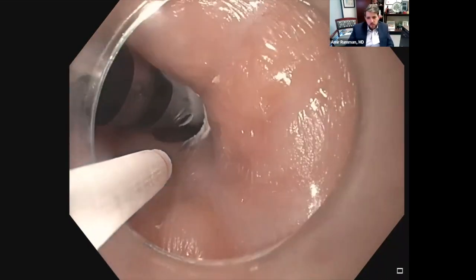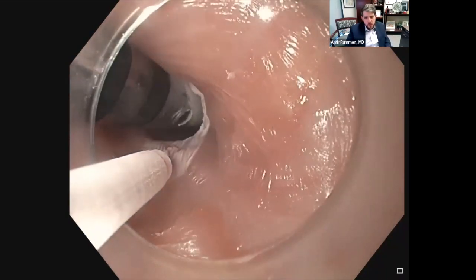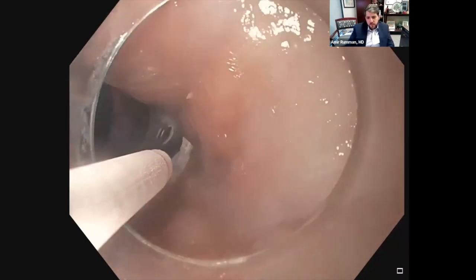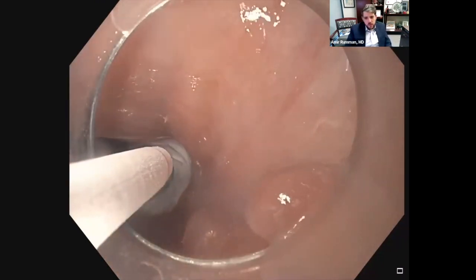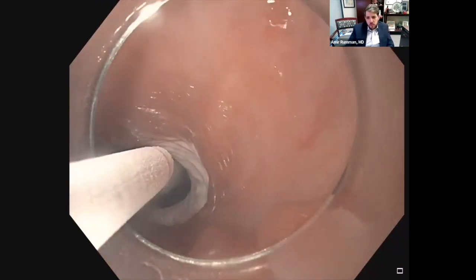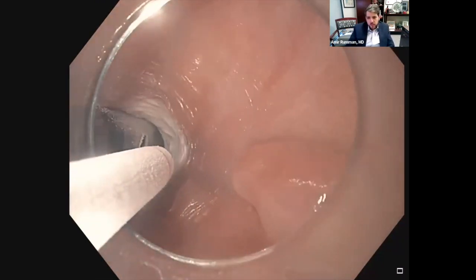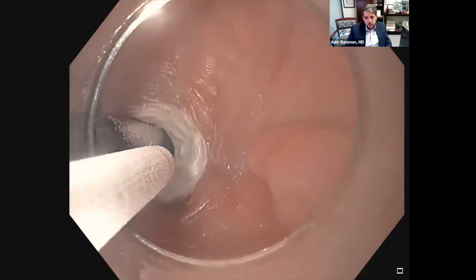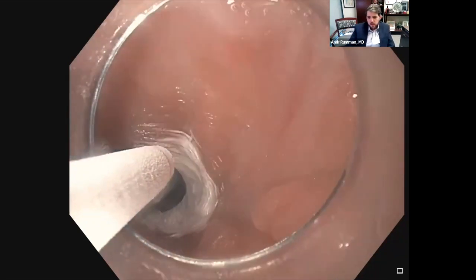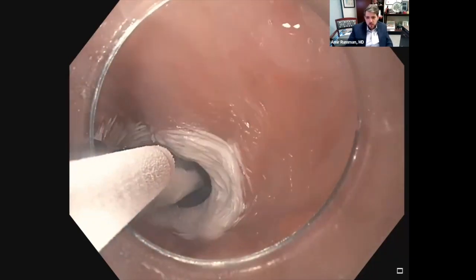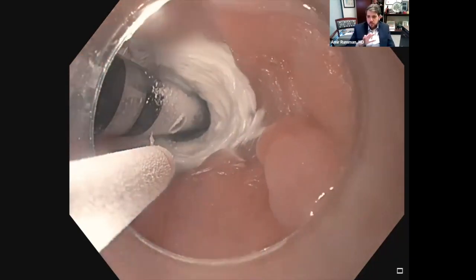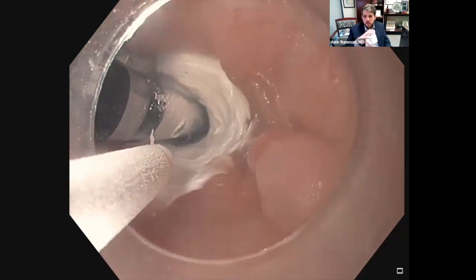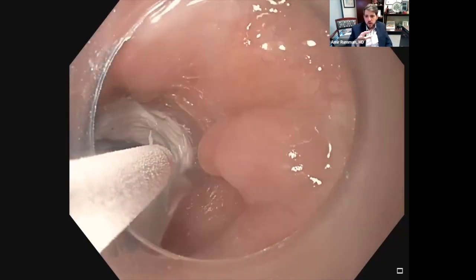And then we're going to start our spray. What I generally do is I will put the catheter out by three or four millimeters, and this allows us to maintain adequate visualization as we're applying the cryogen.